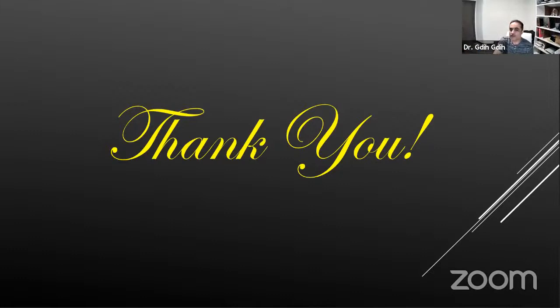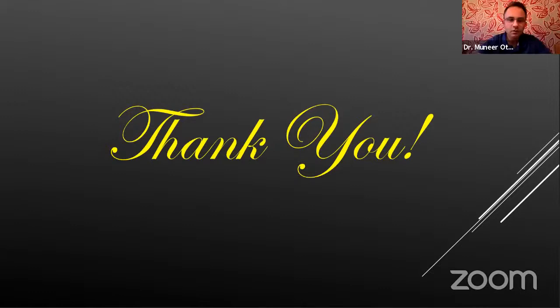The worst visual acuity at which you will perform a visual field test. Yeah, I don't usually do 6/18 or less. It's usually unreliable. But you can always try. You can sometimes try up to 6/24, but 6/18 or less is usually the borderline. Yes, exactly.